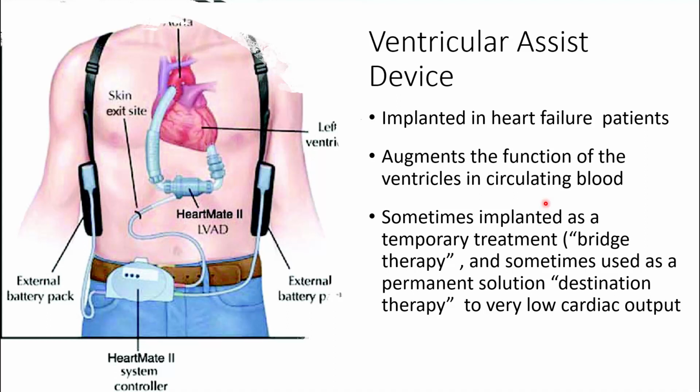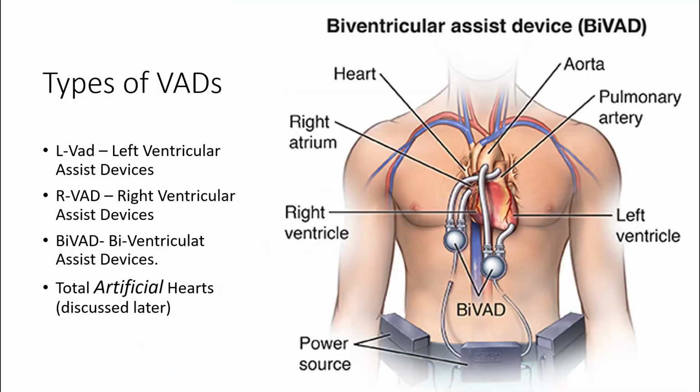Excuse me. For the rest of their life. And that's a very interesting concept as well, because some of these patients are having LVADs, and they wear them out to the point where they have to get a second LVAD because they wore the first one out. Some of these patients, and I have some stats here later, have had LVADs for over 10 years. Not a lot of them, in the grand scheme of things, less than probably 2%, but some of them have them for quite a long time and live remarkably active and fulfilling lives with LVADs.